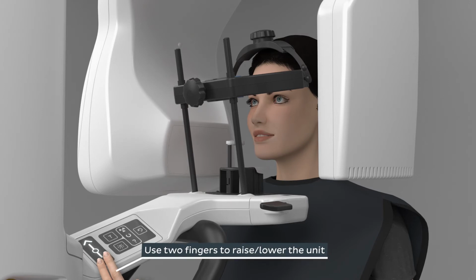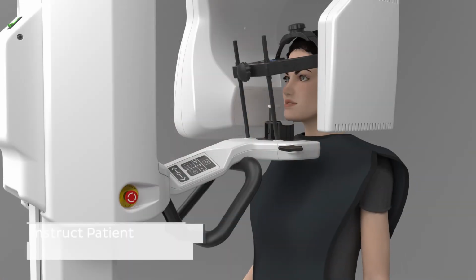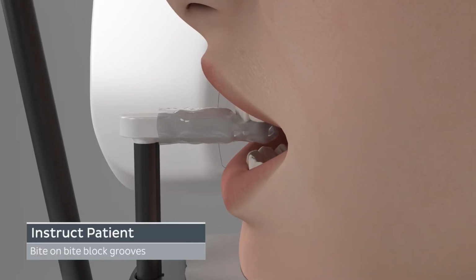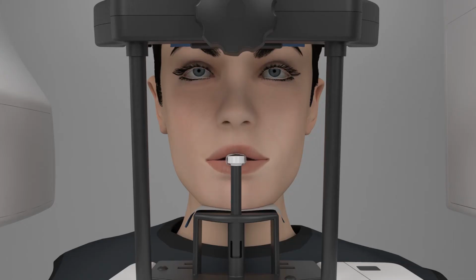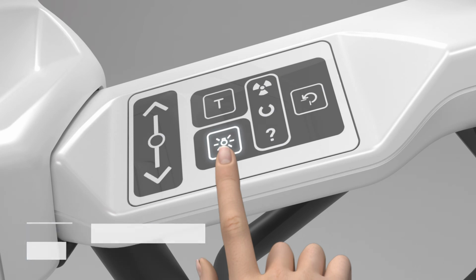With the patient standing outside of the unit, raise or lower as needed so the patient's chin is level with the chin rest. Have the patient step forward, asking them to grasp the patient handles and place their chin onto the chin rest and bite on the bite block so that both the upper and lower anterior teeth are in the bite block's grooves. Tell the patient to close their eyes so you can use the alignment lights to properly position them. Turn on the patient positioning lights by pressing the positioning light button on the control panel.